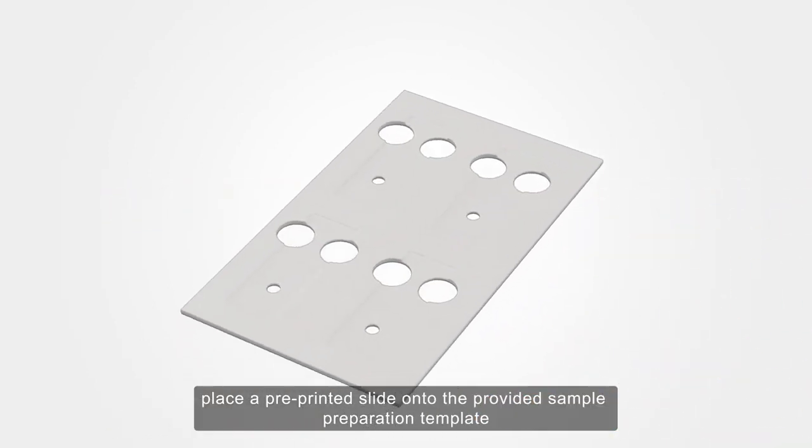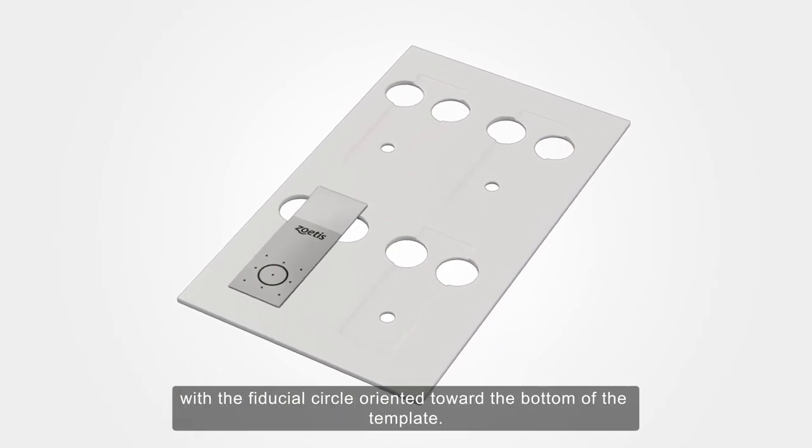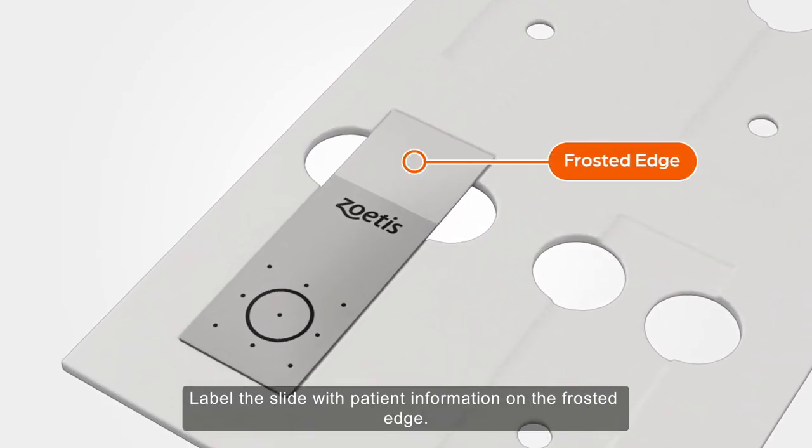While the sample is centrifuging, place a pre-printed slide onto the provided sample preparation template, with the fiducial circle oriented toward the bottom of the template. Label the slide with patient information on the frosted edge.